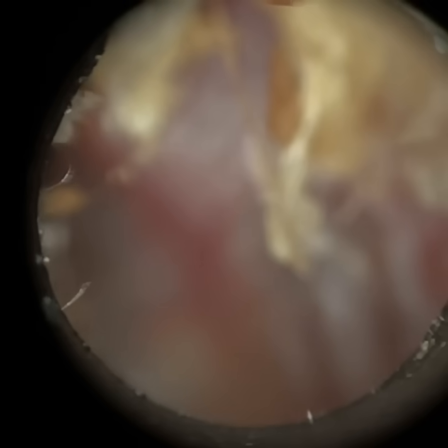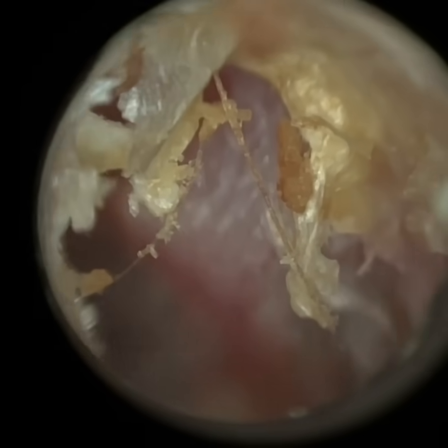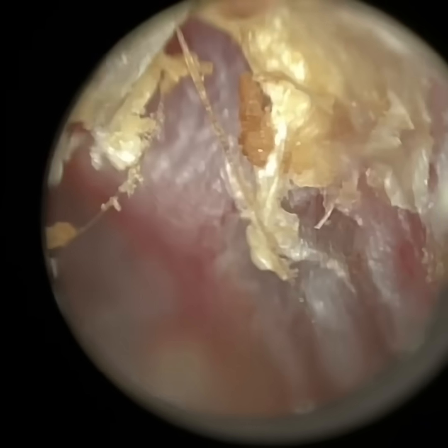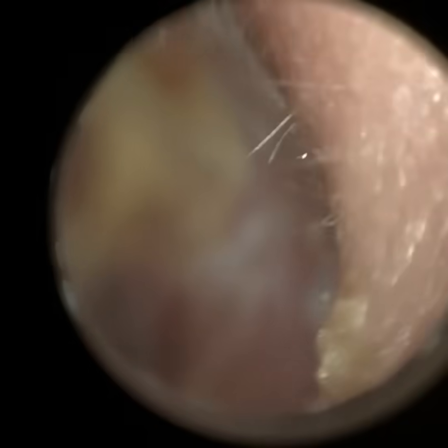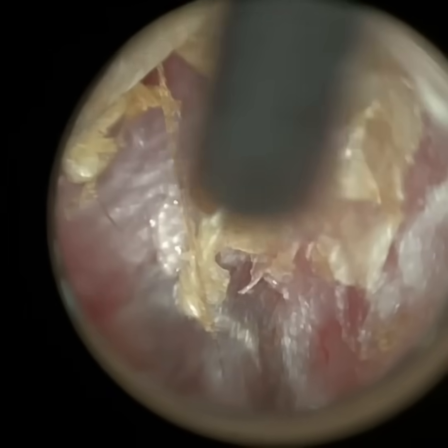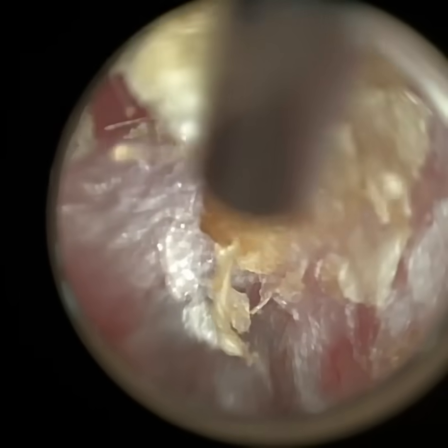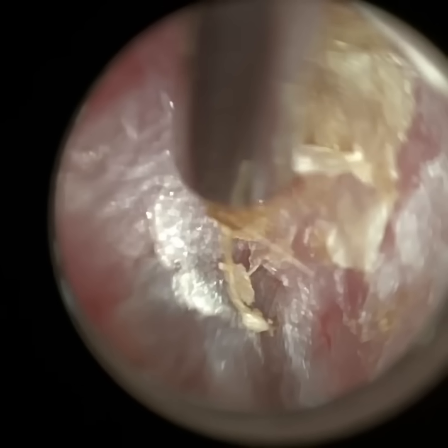This week alone I've had more patients with otitis externa secondary to water exposure. There was a child today, in their left ear, which I'll try and upload in the next few days — it was a pretty short video. They had been swimming during the school holidays and developed an infection as a result. Their ear looked very similar to this, with a very dry, cracked canal surface.